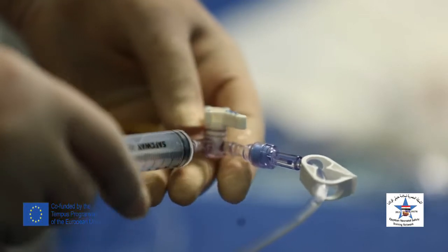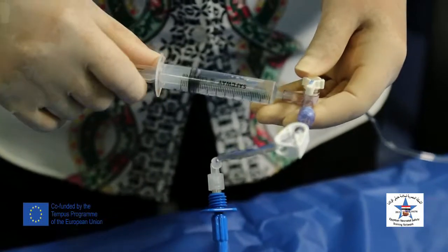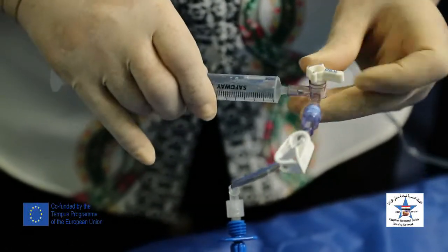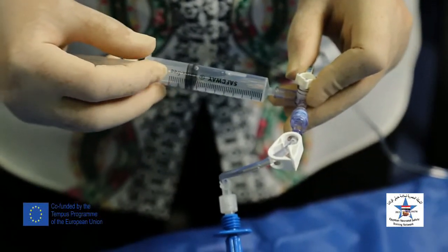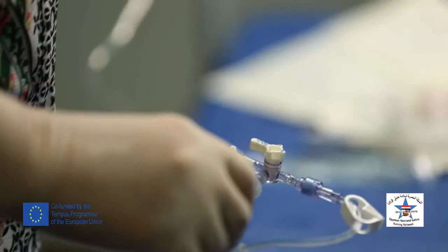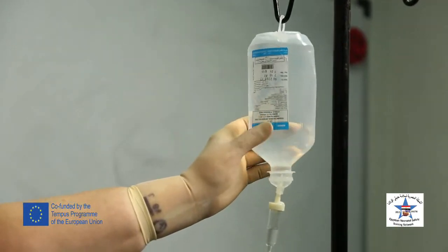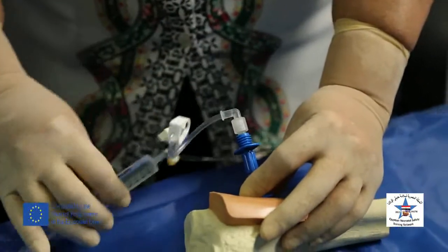So we can either withdraw boluses of 10 ml saline and inject it through the cannula, and repeat it several times, or apply pressure to the fluid pack through a manometer adjusted to 300 millimeters mercury. After that, the fluid is running.